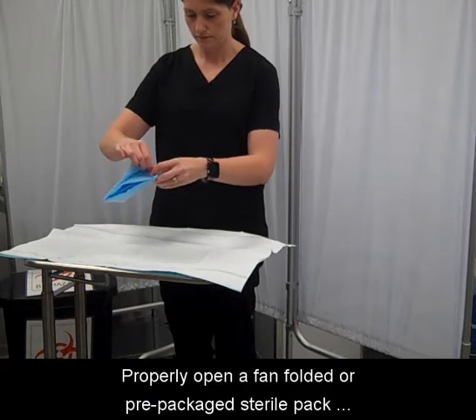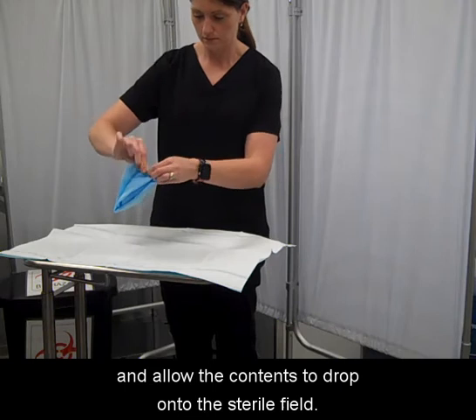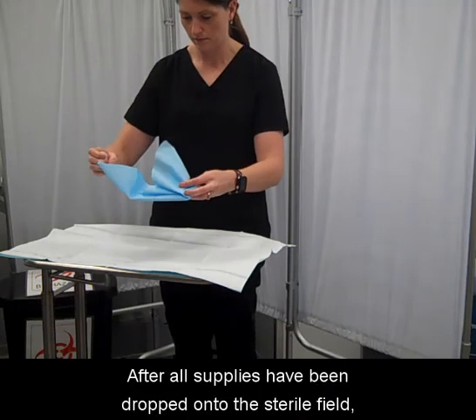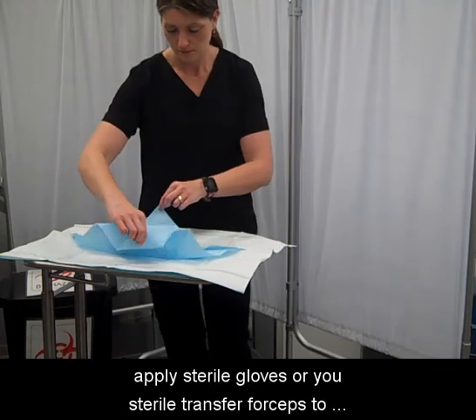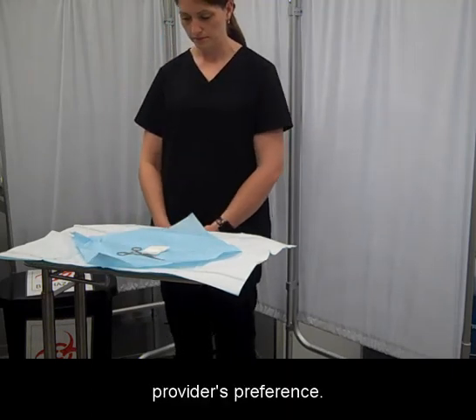Properly open a fan-folded or pre-packaged sterile pack and allow the contents to drop onto the sterile field. After all supplies have been dropped onto the sterile field, apply sterile gloves or use sterile transfer forceps to arrange the instruments on the field according to the provider's preference.